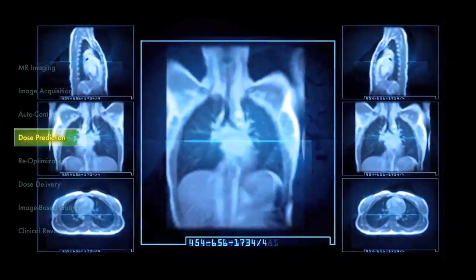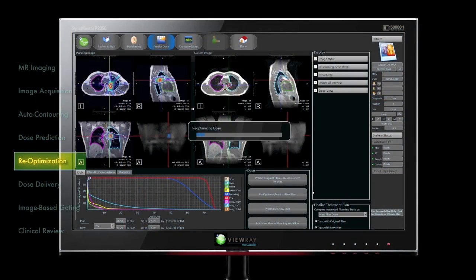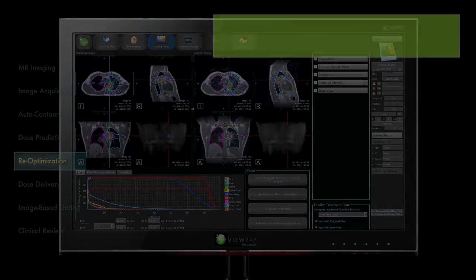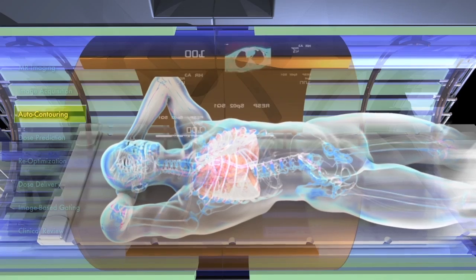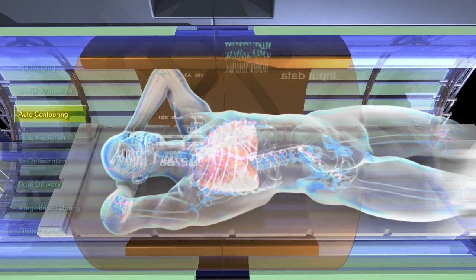The ViewRay system incorporates imaging, dose prediction and re-optimization into a single 15-minute period. Daily positioning images are automatically registered to the original treatment plan, with auto-contouring of targets and structures.